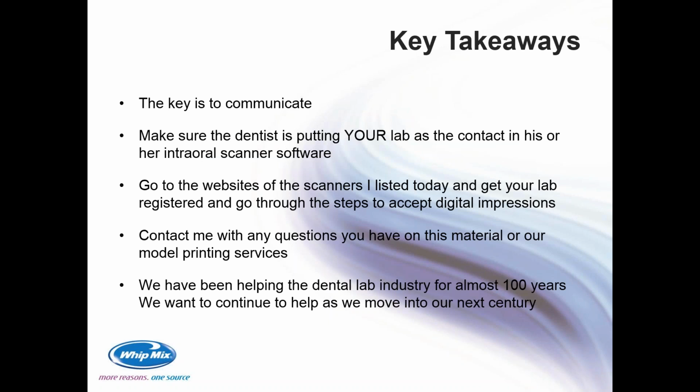I will share with you, I've had a couple labs whose docs went out and got intraoral scanners, and they just figured that the doc wasn't using the intraoral scanner. And it wasn't that at all. It was that whoever set up the intraoral scanner, and there are labs out there that have sales reps that are trained to install the different systems, and so at the time of setup, they're putting their lab in, and that's why, when I say it's one of my key takeaways, just remember it.